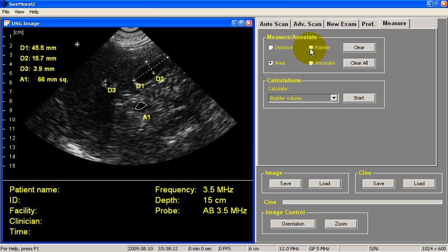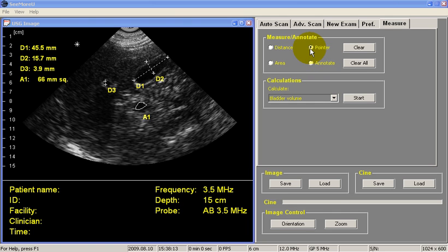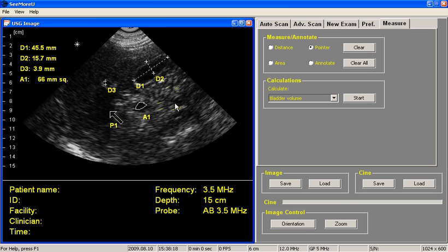To place a pointer on the image, we select the Pointer button, place the arrow on the area we want to point to, right-click, and we can place arrows.